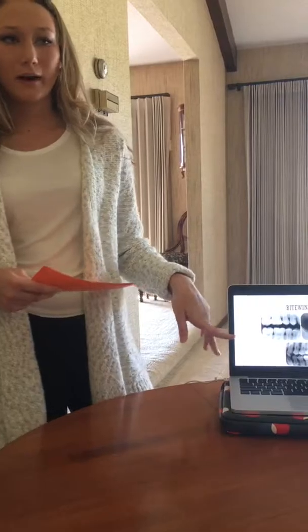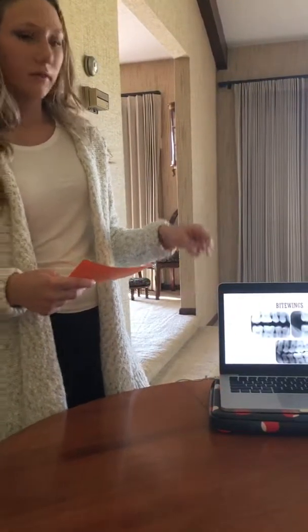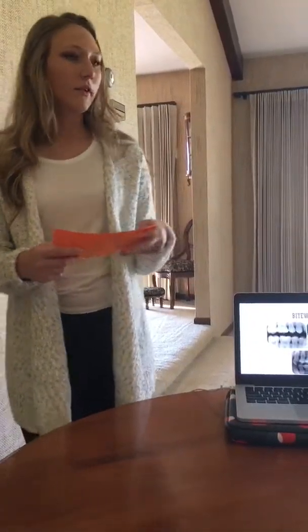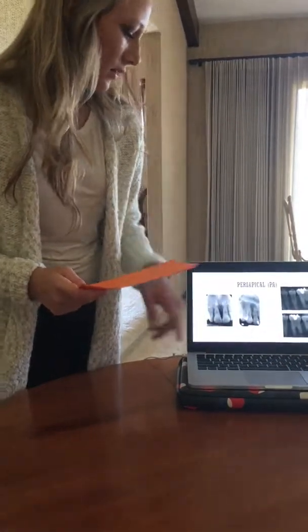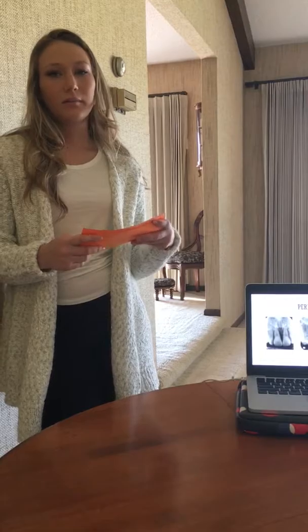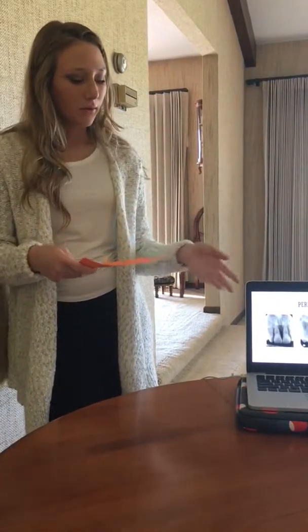It's going to focus on the crown, which is the biting surface of the tooth, and the bone level. As you can see, in between the teeth, there's a grayish area, and that's the bone level. If the bone level goes down too far, that is not good, and we have to take a PA, which will focus more on the root, and this will show more of the bone level also. If the bone level is too low, then we'll need to show it in the PA. This will focus on the root.